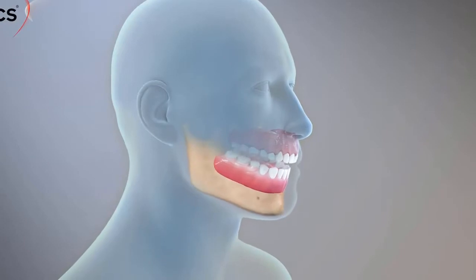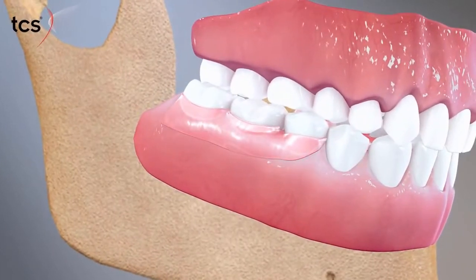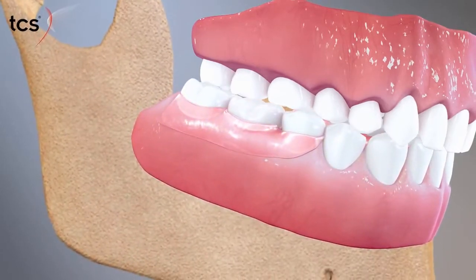TCS Flexible Partials prevent this by distributing masticatory forces evenly over the entire supporting ridge, rather than relying exclusively on key support points. The partial flexes with the natural contours of the mouth as you chew.